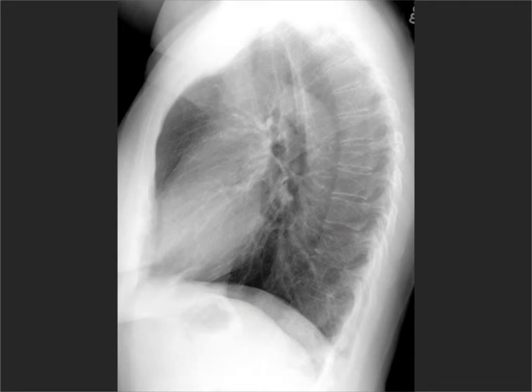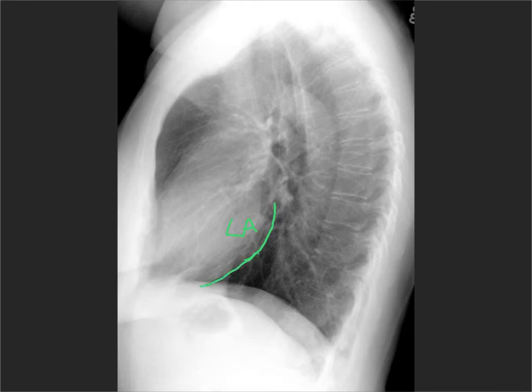Looking at the posterior aspect of the heart — up here is the left atrium. Note where it is: it's the most posterior and the most cranial of the four chambers. The left ventricle is this area here. So left ventricle and left atrium.